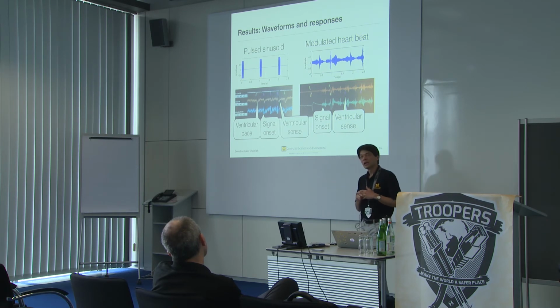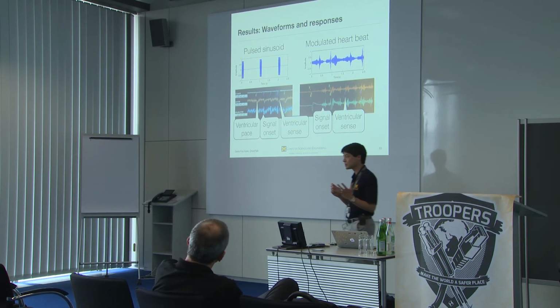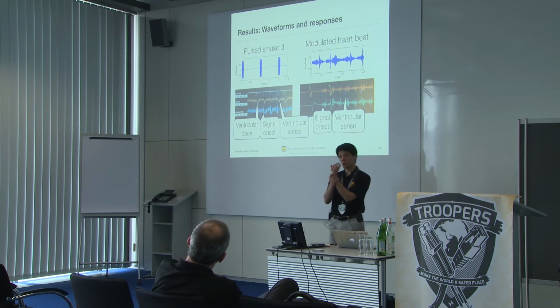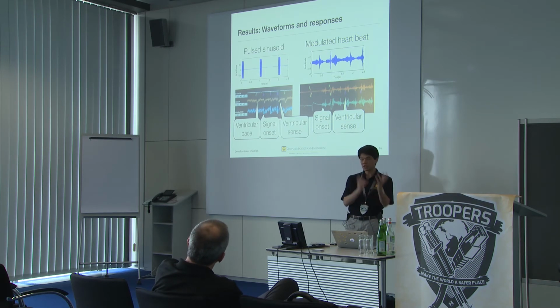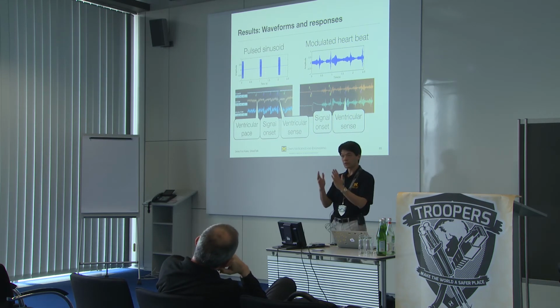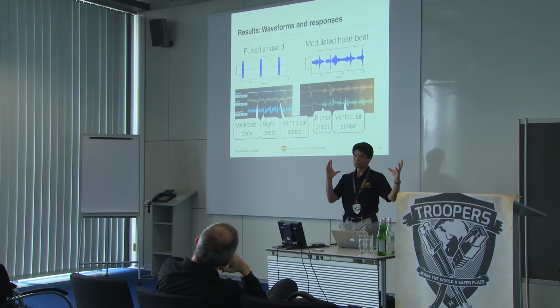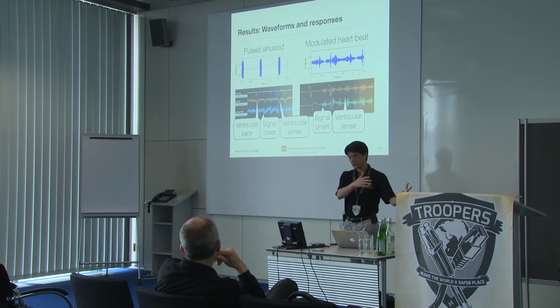But the point is, all sensors have amplifiers and filters. And it's not too hard to measure the resonant frequency of the physical wire between the sensor and the amplifier. From that, you can create a carrier of the optimum frequency, and then you can modulate onto that the chosen signal you want. And then this whole system on the device acts as an unintentional demodulator and delivers the signal to the computer.